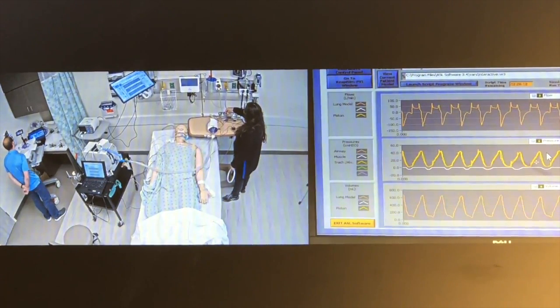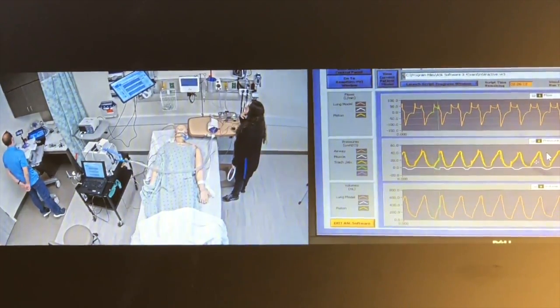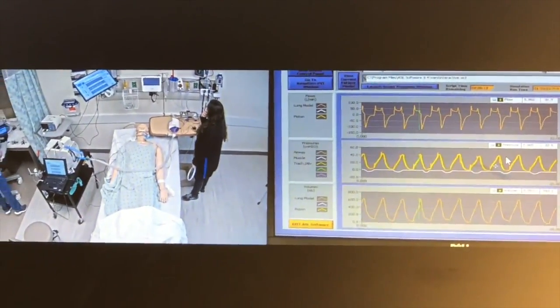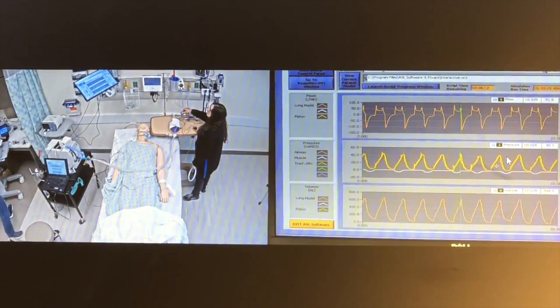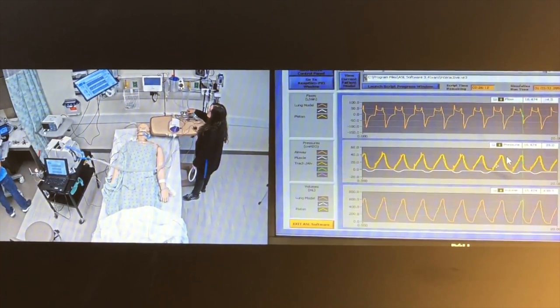Okay, so this is on timing rate as opposed to pressure controlled, and you can see that it's asynchronous. The white line on the center graph is the breathing attempts of the patient at 5 centimeters of water, and you can see the yellow lines are the delivered pressures.